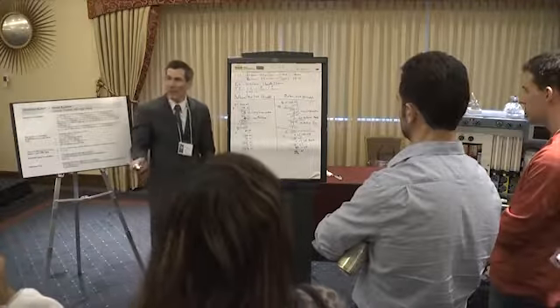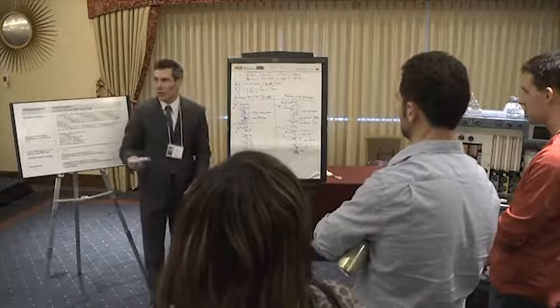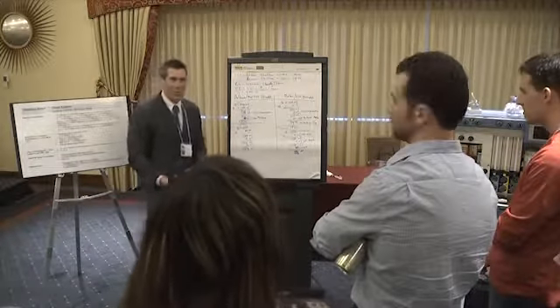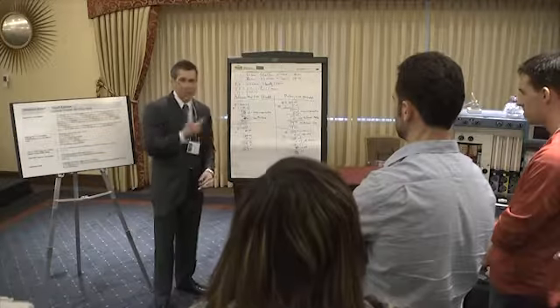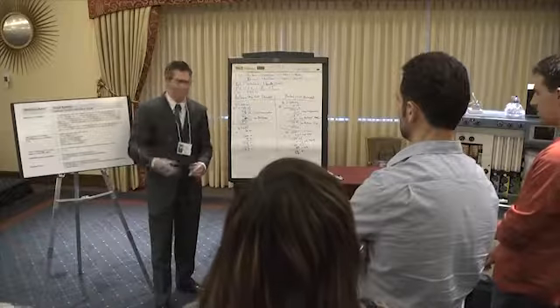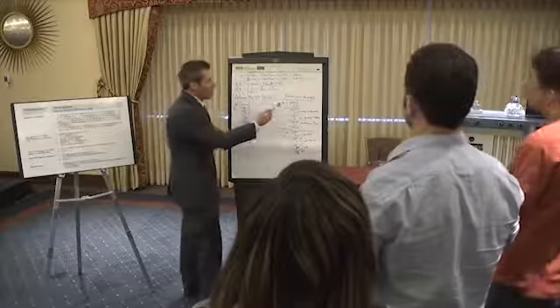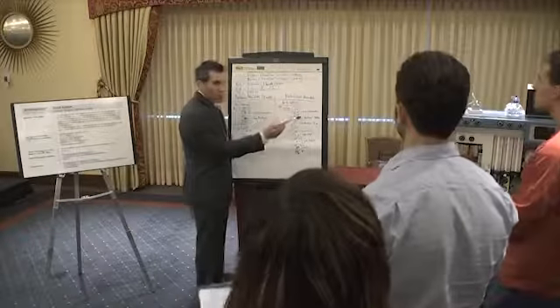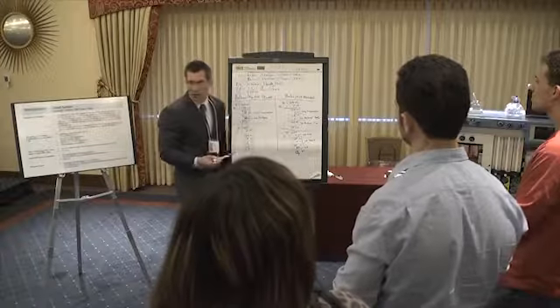But the time that your patient has trouble, so hypothetically your patient has a pneumothorax, your patient starts having trouble oxygenating, you turn up your O2 and crank it up to 8 liters a minute, now all of a sudden you're giving them more volume and subsequently more pressure, right? So by giving more volume, it's going to give more pressure. So when you look at the piston fresh gas flow decoupled machine, we have the 600 tidal volume over here, but the 8 liters a minute does not affect it because we fresh gas flow decouple.